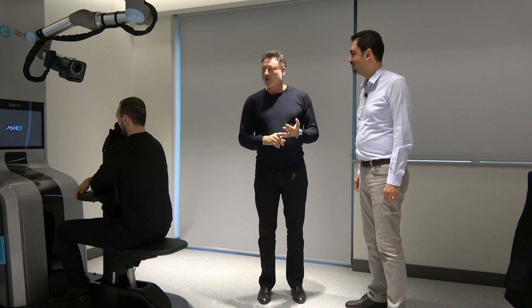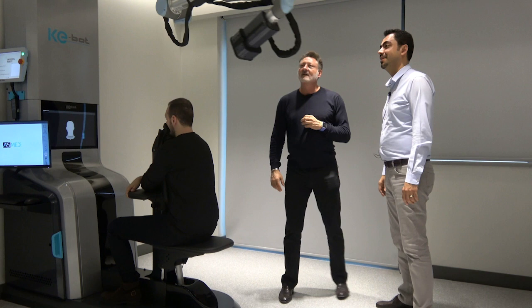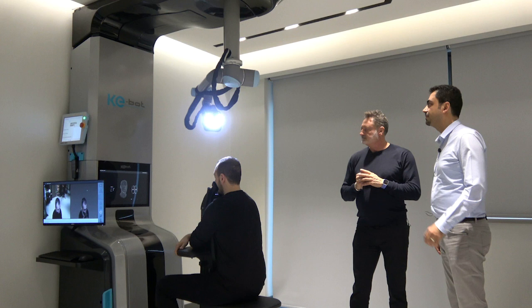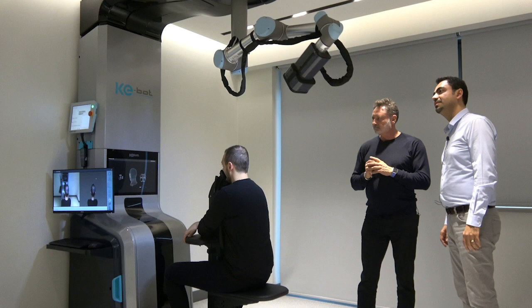This is not a single camera — it's actually a camera system with more than one camera. When you analyze an image of a patient, you create a 3D model. At the first step of this procedure, we create a 3D model of the head. This is what the camera is doing right now — we are taking samples and generating a 3D model.